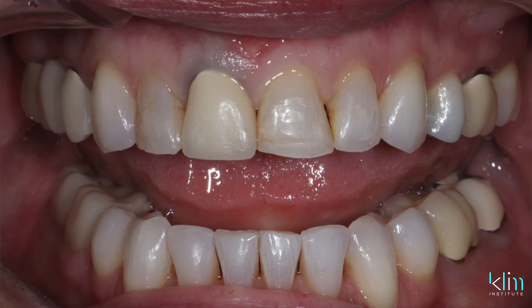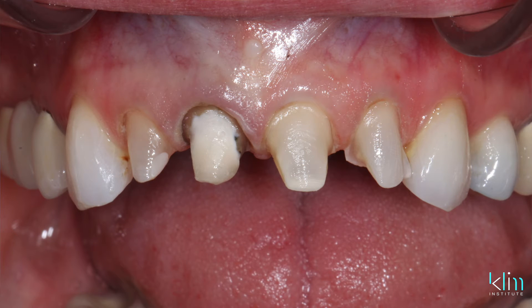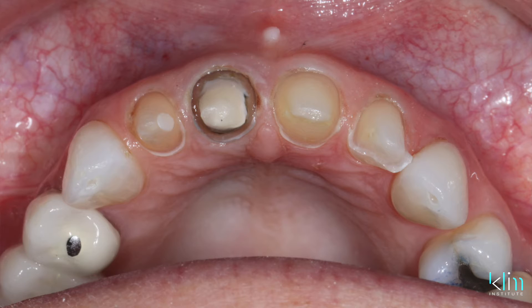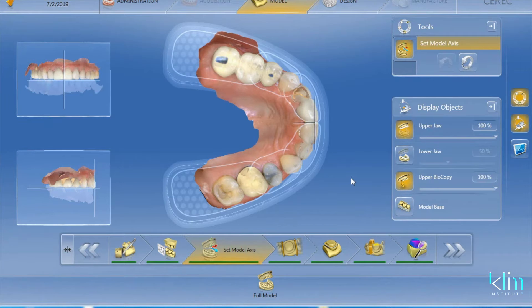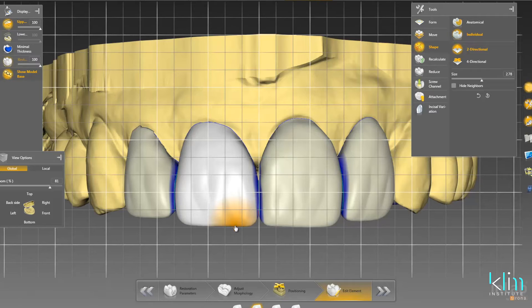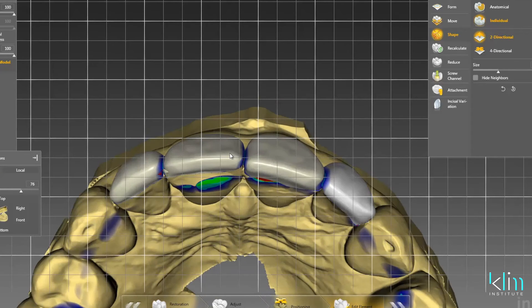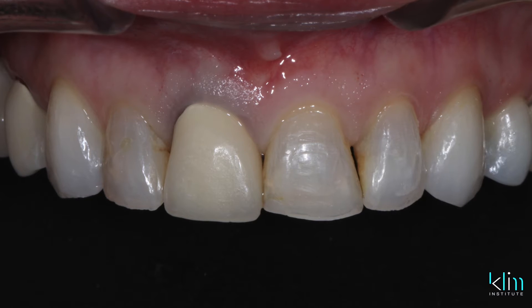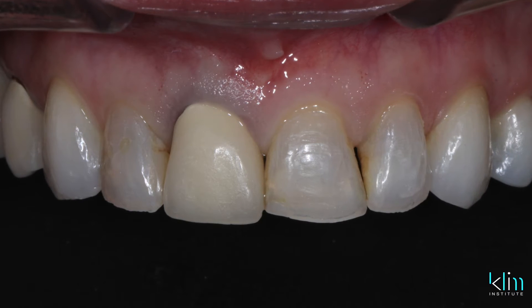This is a case review that will go through those aspects. We're going to start with the design video already posted on the site — this is the intro for that design video. This is a great case: four anterior teeth. We did the mock-up in-lab, did our digital wax-up in-lab, creating a slightly fuller look, except for the crown on number eight which is a little too full and bulky.